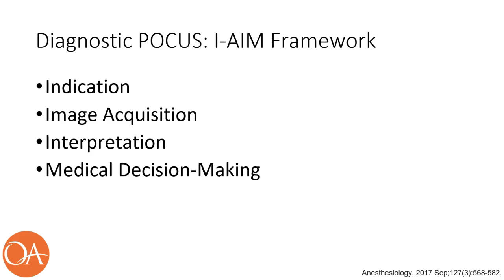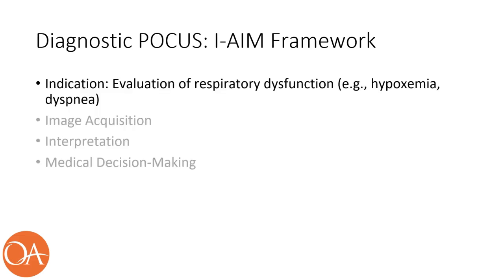To structure our discussion of the patient's lung ultrasound evaluation, we'll use a helpful mnemonic that has been proposed to guide integration of diagnostic point-of-care ultrasound into routine clinical care. The mnemonic is IAIM, which stands for Indication, Acquisition, Interpretation, and Medical Decision-Making.